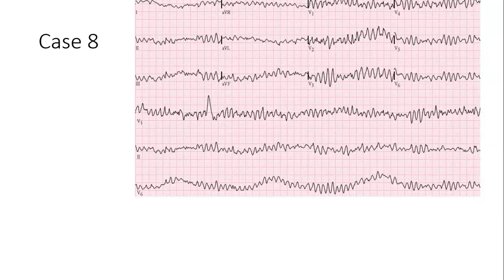Okay, last question. I want the same person who was answering, or another male. Sorry, am I being sexist? But yeah. What is the physics of a defibrillator and how does it work? This is not an unfair question.